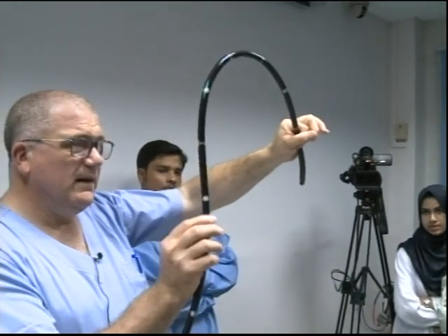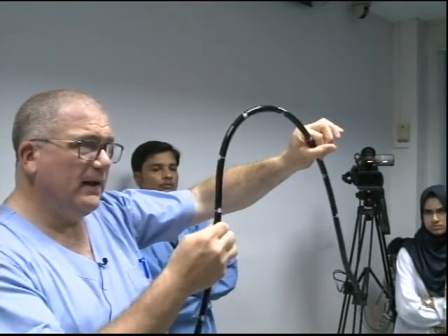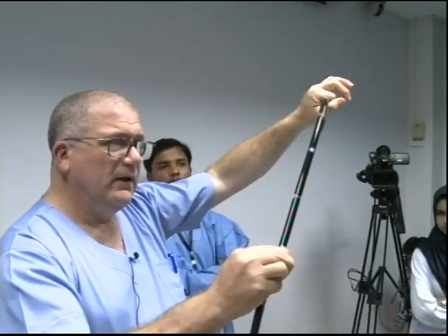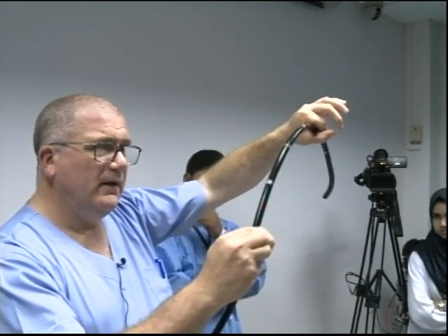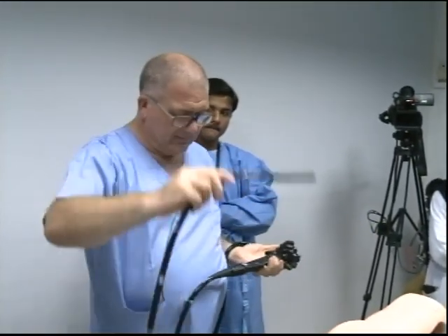Watch. Here we go again. I apply clockwise torque. See the scope step forward? I let go of that, and then it'll do that. So when we actually reduce with torque, where we've finished, we then continue with that torque in. In other words, watch the thumb. I come back, the torque is now with the thumb at 5, I go forward, yeah, I let go of it, even though the thumb is there. So wherever you end up with your thumb, you then go forward with your thumb, yeah? So torque steering is quite simple when you look at it in that sense.